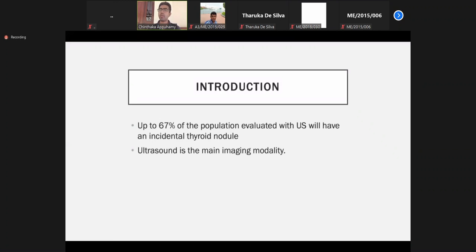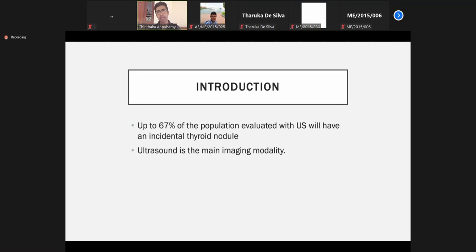When we do an ultrasound scan of the thyroid, two-thirds of the population will have some sort of nodules. Out of them, the majority are benign. I will teach you how to see whether they are benign or whether they are suspicious.